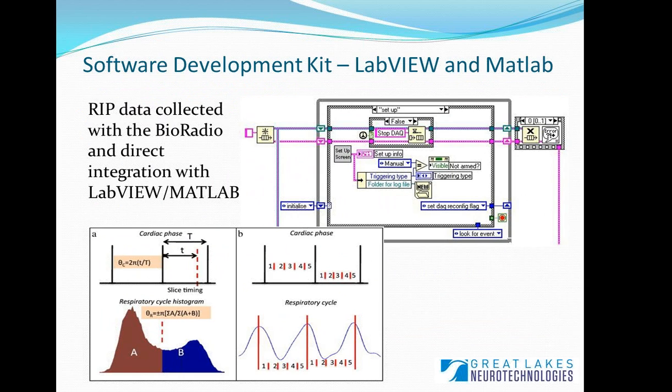But the next option that we have for data analysis is what we call the software development kit. I mentioned that if you do your own analysis in MATLAB, you can export data either from the BioCapture data acquisition software or from the VivoSense analysis software to import those data files into MATLAB and create your own respiratory plots if that was of interest to you.